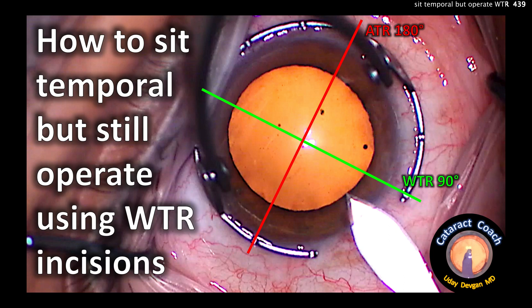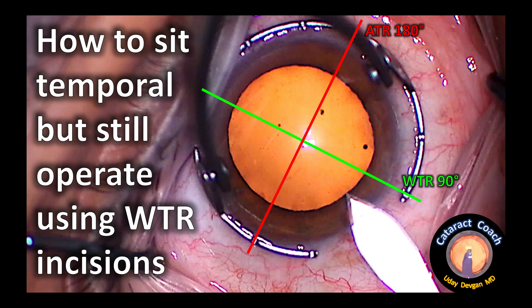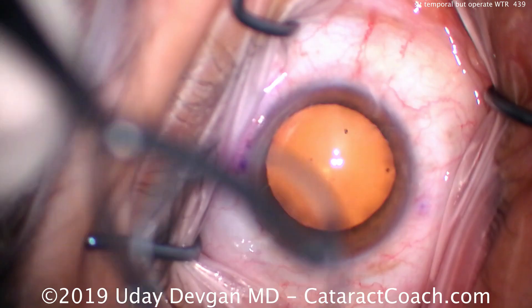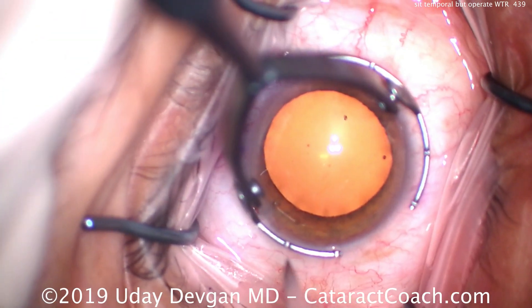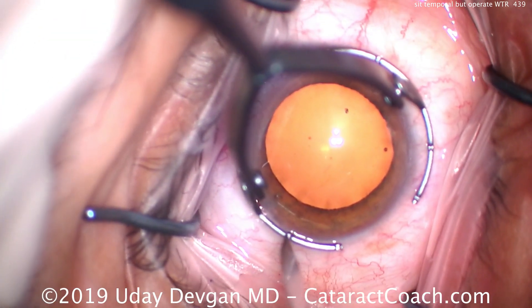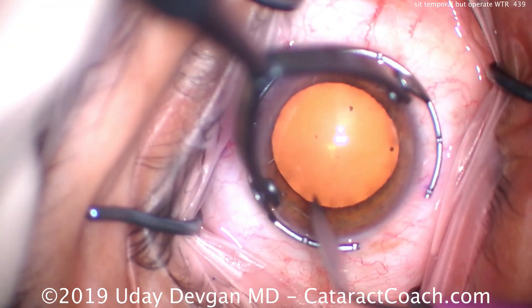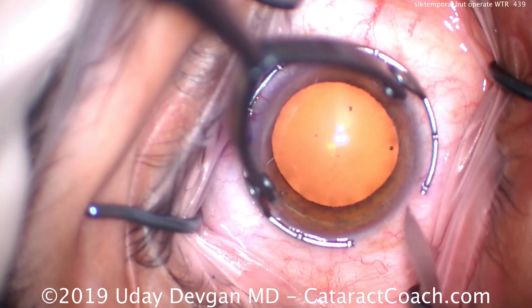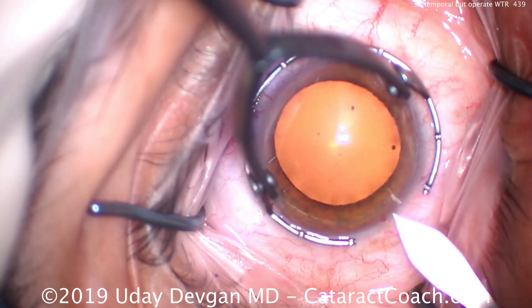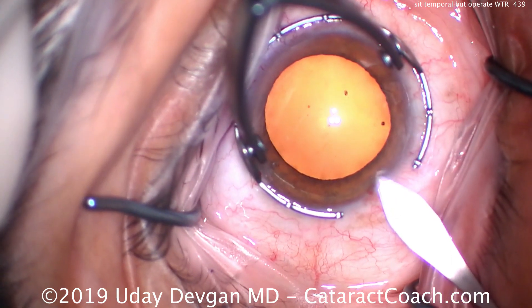cataractcoach.com — how to sit temporally but still operate using with-the-rule incisions. This is a patient where we're sitting temporally at about the 180 or zero degree mark, but this patient has with-the-rule astigmatism and a steep axis at about 75 degrees.